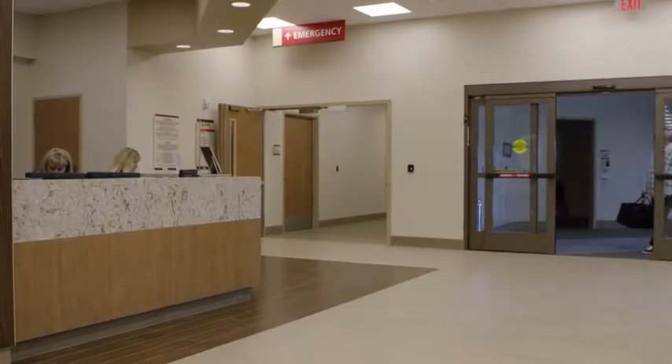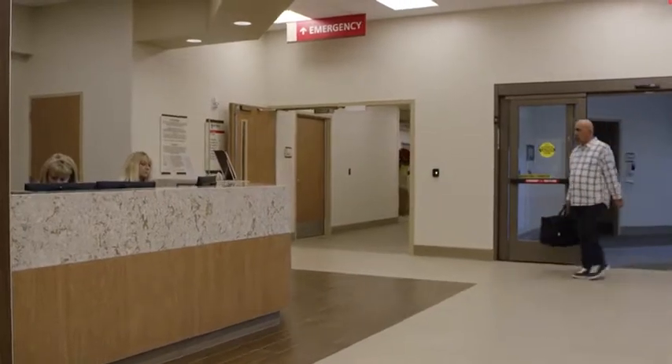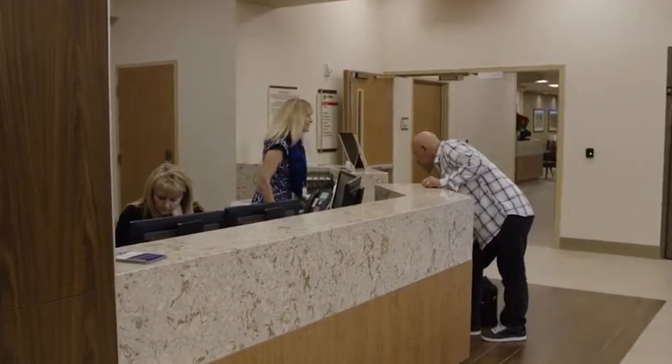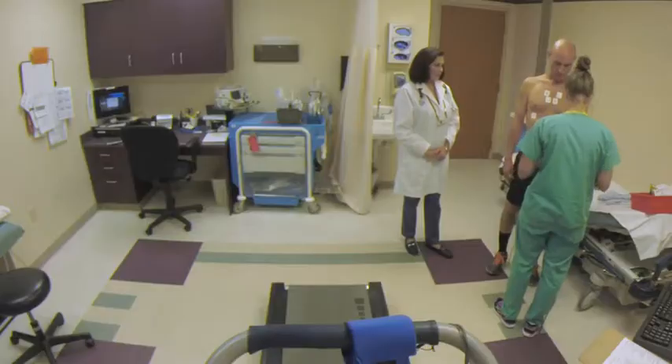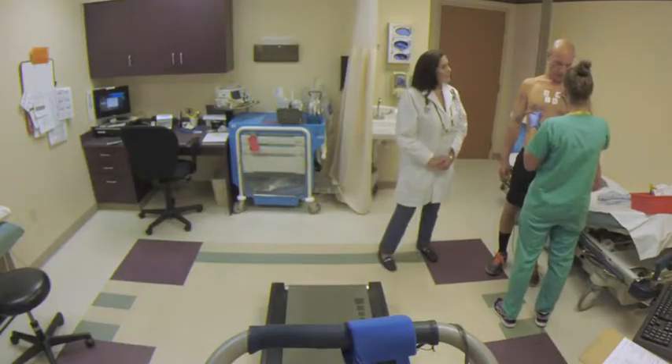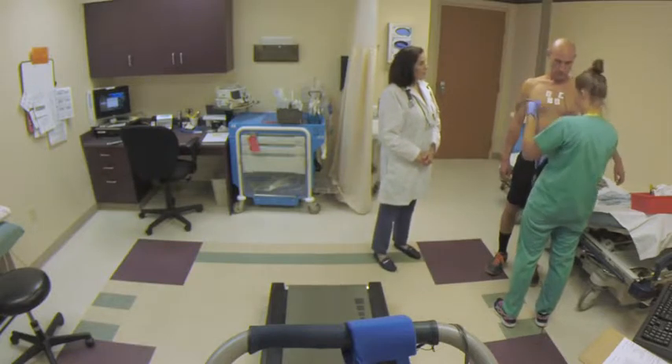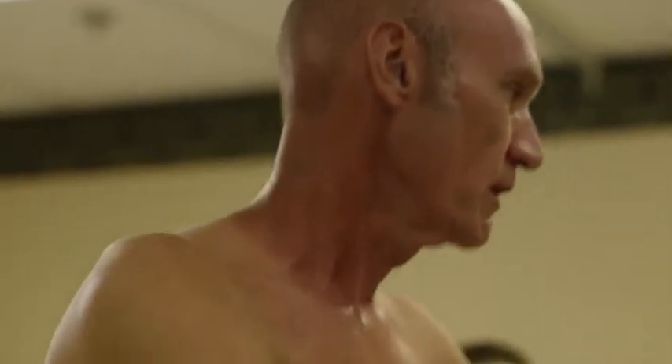Wear comfortable, loose-fitting clothes and good walking shoes. The test will take about an hour or two, including test setup and monitoring afterward. Right before your exercise test, someone will hook you up to an electrocardiogram, or EKG machine, which is used to monitor your heart rhythm.